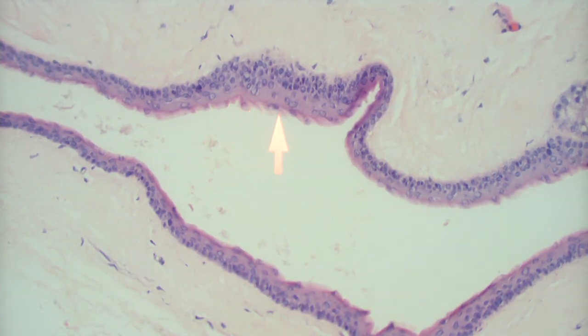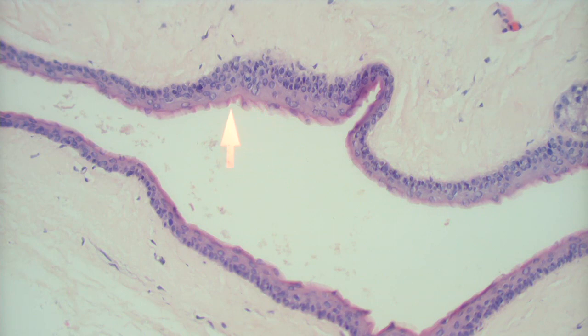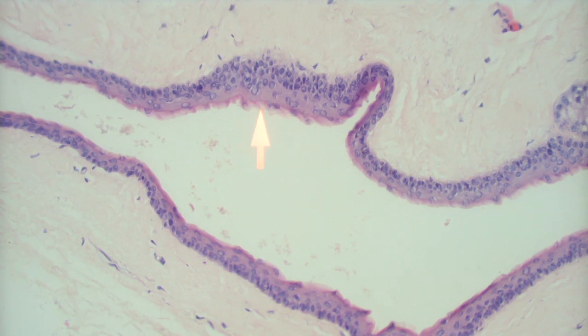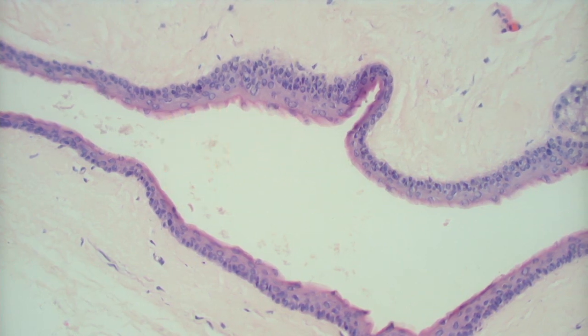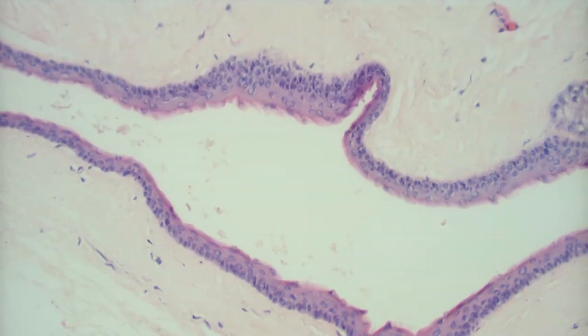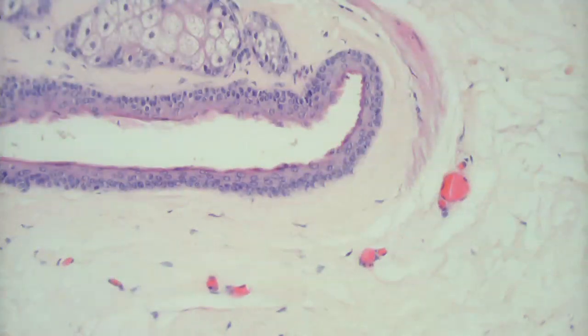The cuticle. And what does the cuticle look like in steatocystoma? Some say shark tooth. Yeah, good. Corrugated. It's got a very special kind of cornified material. This is keratin here, but it's got this corrugated pink lining. It doesn't really have much of a granular cell layer. So if you see that coupled with sebaceous glands in the wall, you've got a definitive diagnosis of steatocystoma.